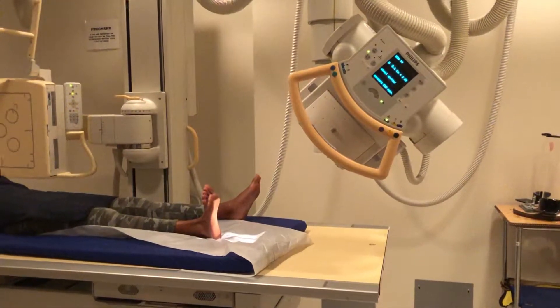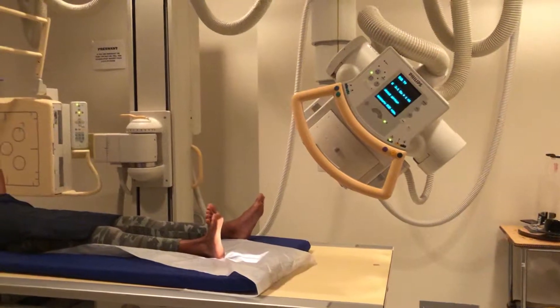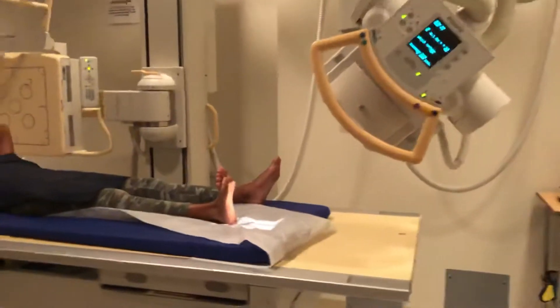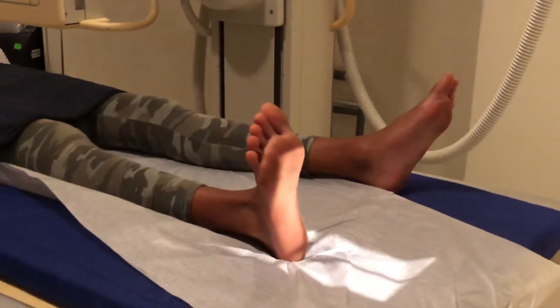Hi, you clicked on this link because you want to know how to take an x-ray of the heel, or os calcis, and I'm going to show you how to do it perfectly every time. So this is an x-ray of the heel — we do two views on that: it's an axial, which it's set up for right now, and then we do a lateral.